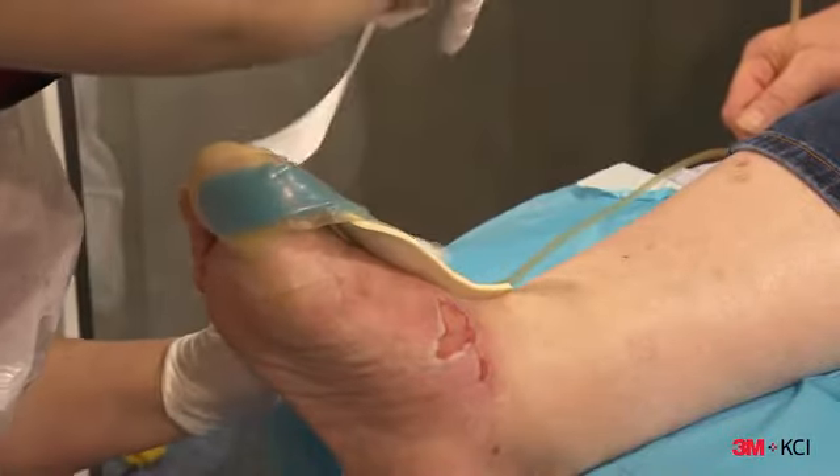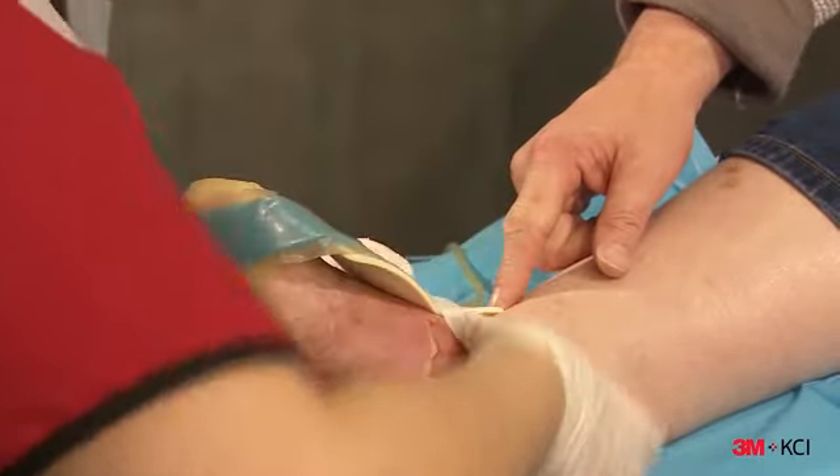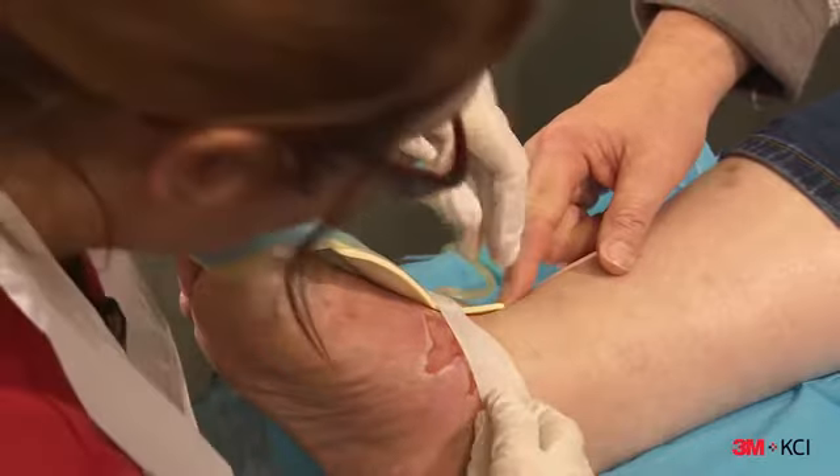Next, route the bridge section of the dressing away from the wound to help mitigate additional pressure at the wound and secure the bridge section to the patient.